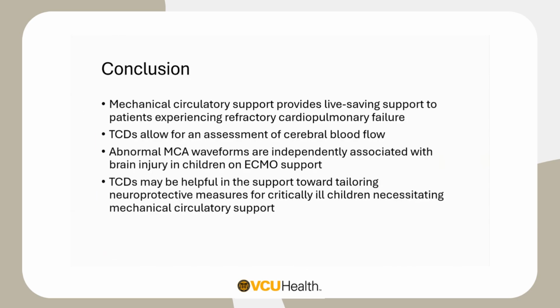In conclusion, mechanical circulatory support provides life-saving support to children with refractory cardiopulmonary failure. TCDs allow for an assessment of cerebral blood flow. You can use MCA waveforms and look at their asymmetry as a way to assess risk of brain injury. We showed that it was independently associated with brain injury, and TCDs may be helpful in optimizing neuroprotection measures for children on mechanical circulatory support, with a lot of knowledge gaps and research opportunities moving forward.